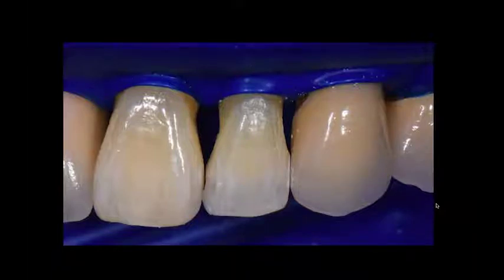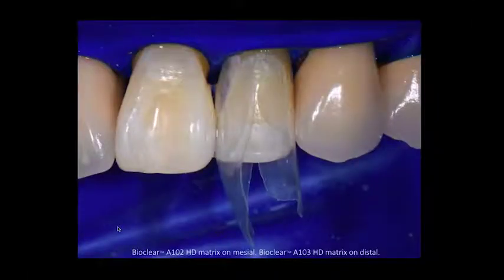So here's another case that I wanted to show. The goal in this case was not to block color, but basically to treat the open gingival embrasures and to treat a little bit of decay on the lingual surface of these teeth. And because we were not changing the adjacent restoration, which is quite dark, there's also a left or a right central incisor that has had a crown. Because we're not able to change the existing porcelain restorations, we weren't looking to change any of the color, but we wanted to have everything blend as well as possible.